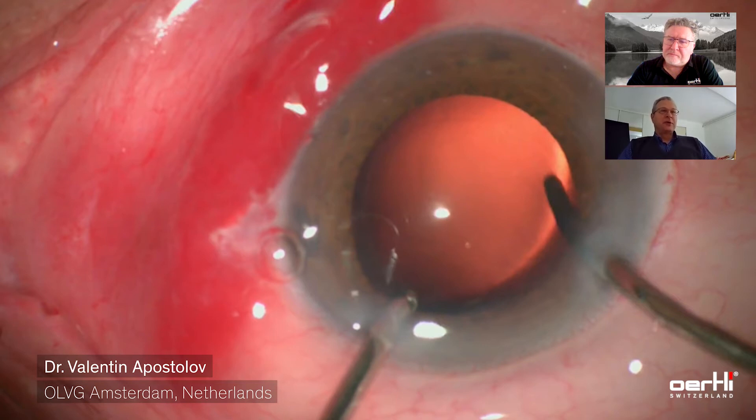A safe option is using the silicone-tipped coaxial irrigation aspiration, because it's almost impossible to make a capsular rent with it, and it also adheres nicely to the capsule. The lens cells tend to get stuck to the silicone material, so that's also a good option — and in less experienced hands, it may be the safer option. But with these irrigation aspiration tips, I never had a posterior capsule break, so I feel completely confident in polishing the posterior capsule.